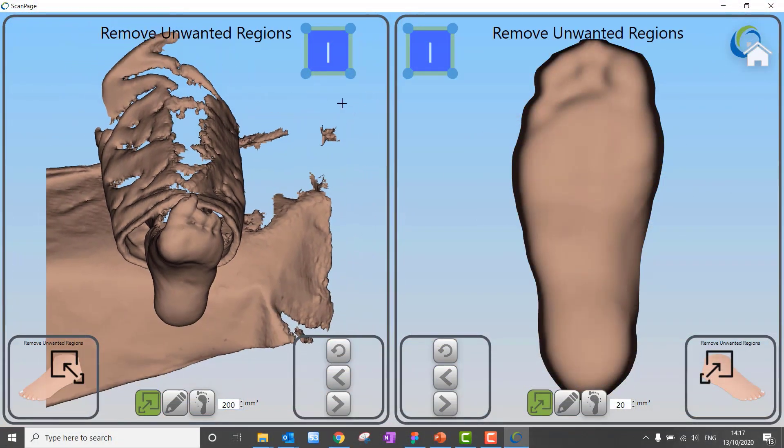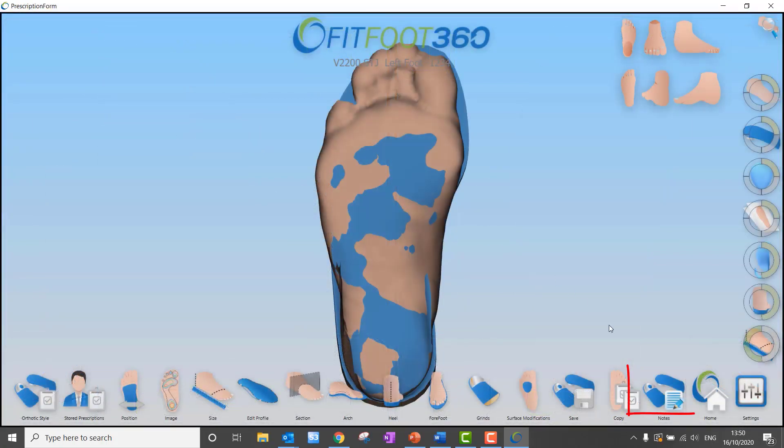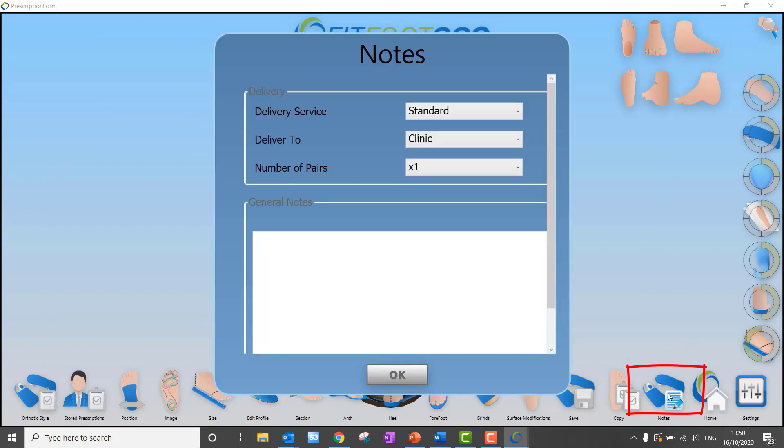In the scan area, being able to remove data was always a challenge, but now we've sped the process up and give you much more control over scan data. We've also added notes into the software where you can add information that you can carry through into your manufacturing process later down the line.